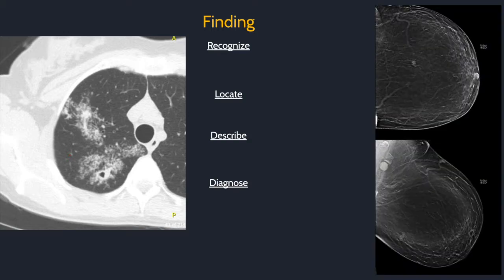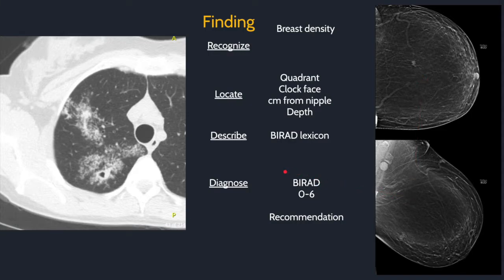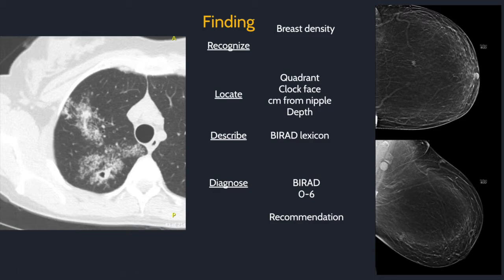Breast imaging is very similar. For a mammogram, we first start with breast density — this one is almost entirely fatty. Then we recognize the lesion, locate it with descriptors (this one would be in the lower left breast at 6 o'clock, 10 centimeters from the nipple in the middle depth), then describe the lesion with the BI-RADS lexicon: an equal density irregular mass with spiculated margins. Then give it a BI-RADS number and recommendation — BI-RADS 5, recommend biopsy. We'll go through each of these steps one by one and spend most of the time on location, because that is the most confusing concept.